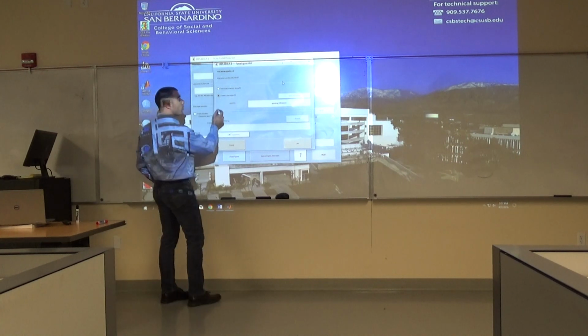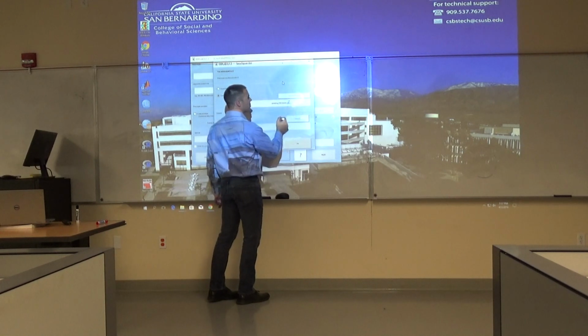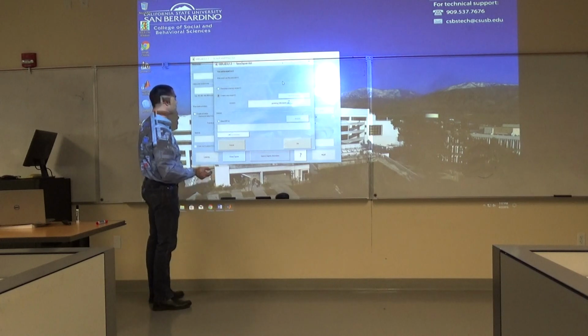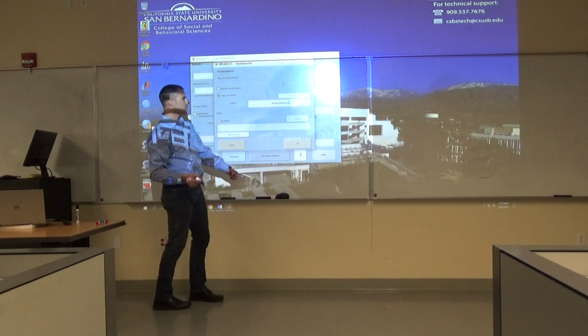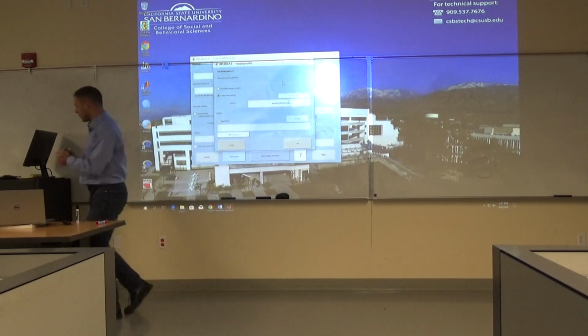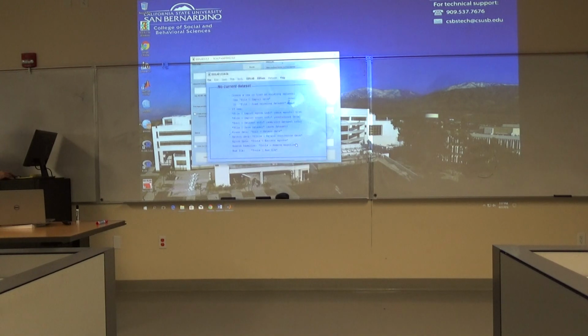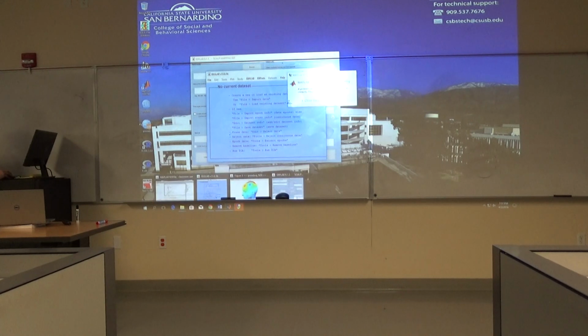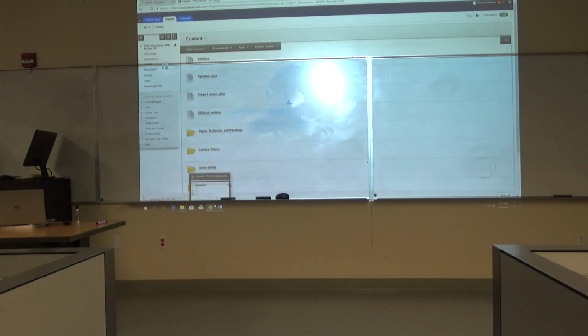You're going to want to name it something. So for fun, just for today, I would just add the number 2 at the end there. You can just try doing that for now. Number 2. Oh, I have an error. You might too. I'm going to say attempt to continue. Maybe it'll work, maybe it won't. I have to close. That's okay. We saw that happen before when I did this last time, and we know it works because I got to the 3D head.